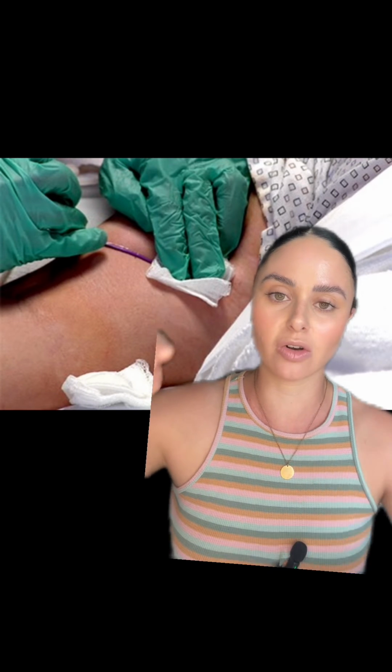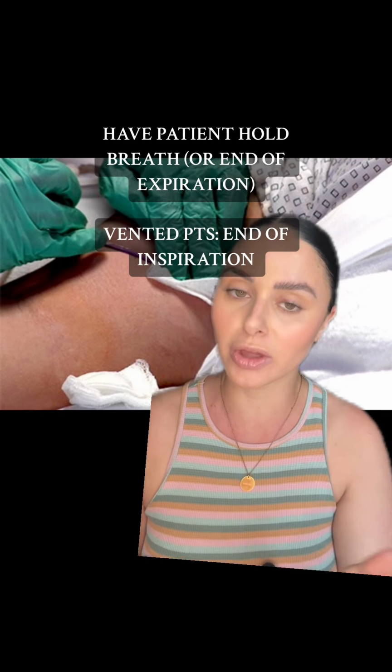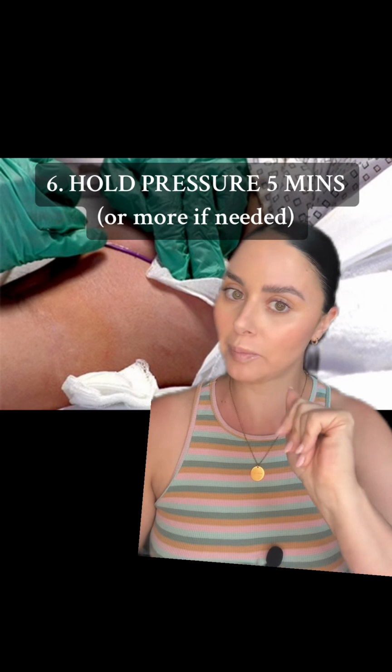When you go to remove the line, this is a great technique. You're taking the sterile gauze, holding it over the site, removing the line, but you're going to want to make sure you do this at the end of expiration, or just have your patient hold their breath. And if your patient is vented, then you are going to want to perform the removal, pulling the line at the end of inspiration. Once you pull the line, you're going to hold pressure with that sterile gauze for about 5 minutes. Don't peek, give it 5 minutes so you can really get that bleeding to stop.